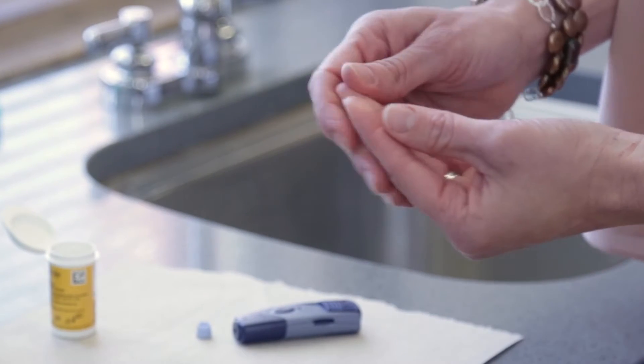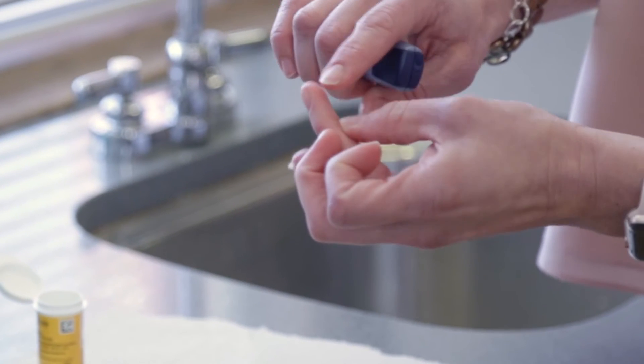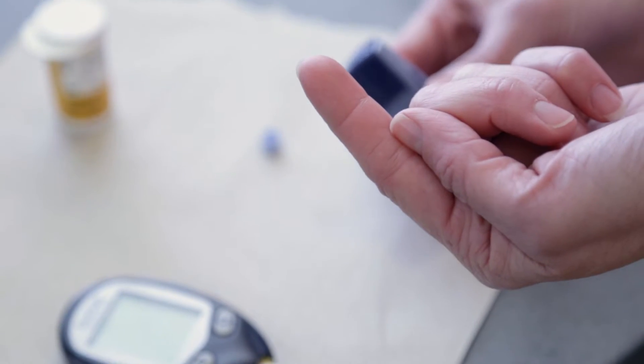Choose a finger to get a blood sample from. The best location to get a sample from is either side of the finger, avoiding the tip. Each time you test, change the lancet and rotate test sites often to avoid skin breakdown.